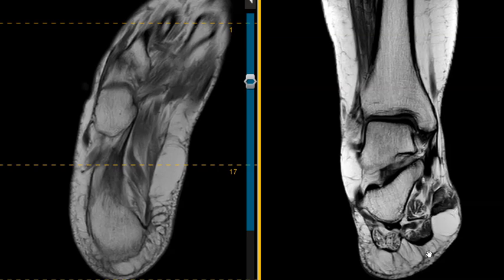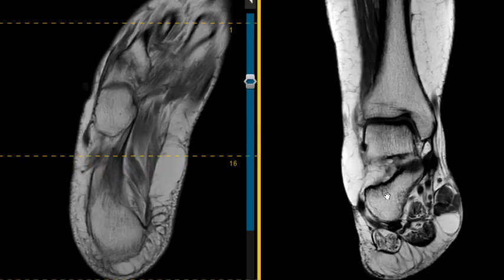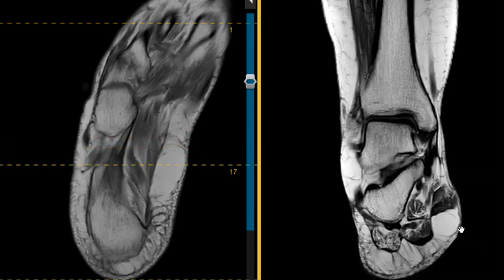You can see how different it is from the other ones. But if someone said this is a lipoma, there'd be no way to argue against them. But again, we just see this very commonly. And here's another collection here on the outside. It bulges out. So asymmetric adipose deposition, or I guess it could be lipomas that just are asymptomatic.